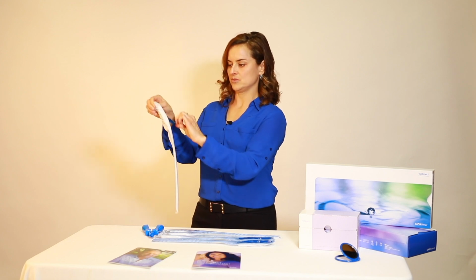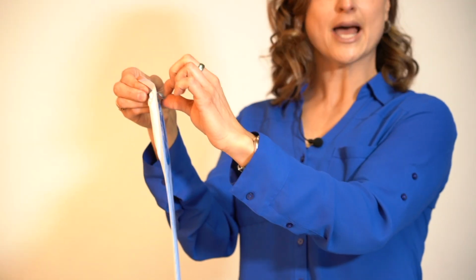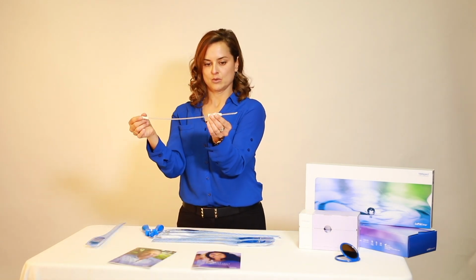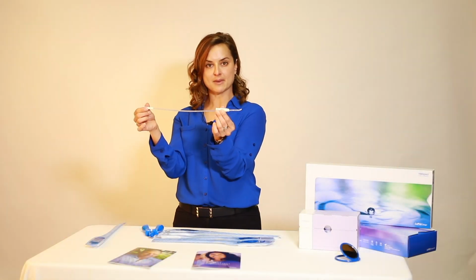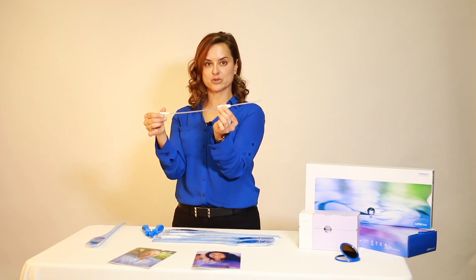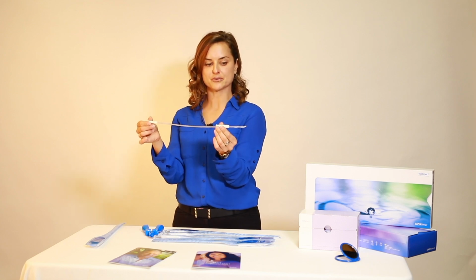Okay, just going to demonstrate how to take the catheter out of the package. So there's a tab that you pull down in the front to expose the catheter. The LoFric Origo has an insertion grip which allows the catheterization procedure to be a touchless method, and it also improves the handling that you have when you're inserting and withdrawing the catheter, so it improves your control during catheterization.